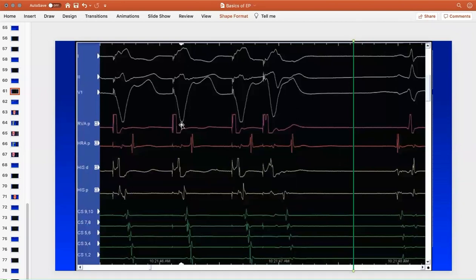So the next step, as you said, how are you conducting to the other chamber? Are you conducting to the A with every beat? Yes, conducting with the first, second, third, and fourth. Okay, good. So how are you conducting? We are conducting retrogradely through the AV node. Your earliest activation is in the His, then the coronary sinus CS9 proximal, and then the A.